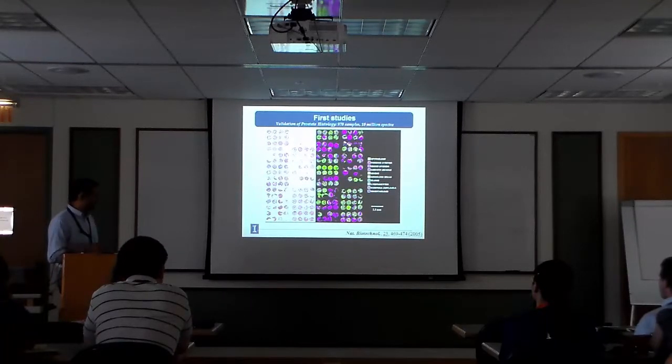This study really launched the time period where this kind of analysis was possible. And what we did here, this took us almost 3 years to acquire the data, was take 8 samples from a single patient, a second patient, third patient, one clinical setting, second clinical setting, and so on.